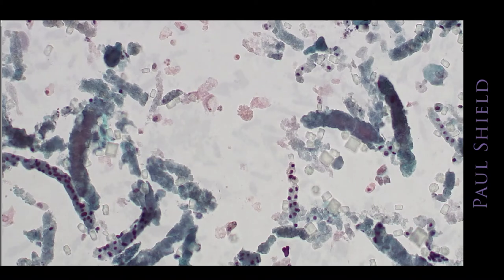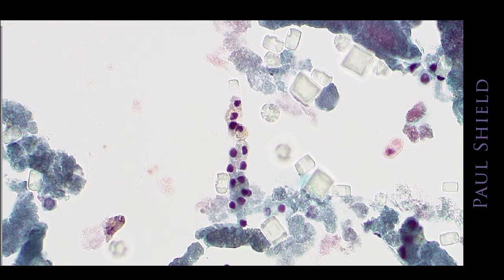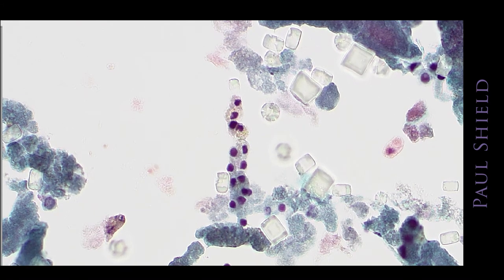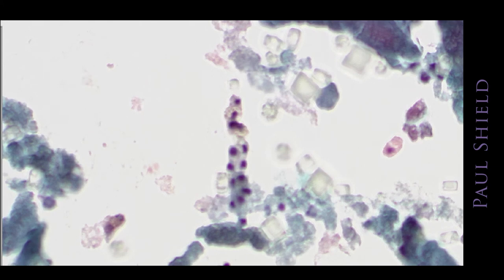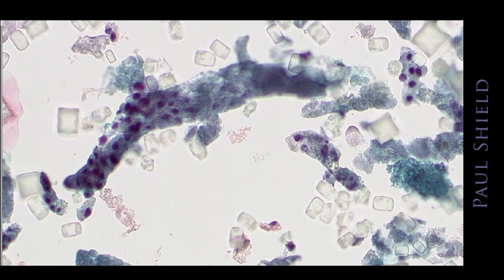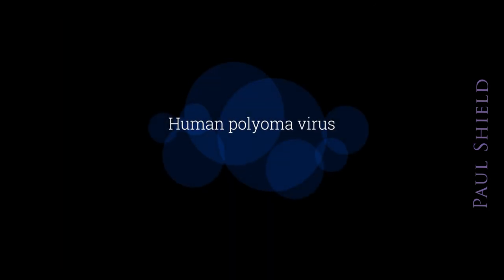And this is a case that's got extensive casts all over it. And some of these are cellular casts. So see this one down here has little dead pycnotic cells in it. These are renal tubular cells. So sometimes casts will come out with degenerate renal tubular cells present in them. There's another one there that seems to be cellular as well. But normally we don't see cells from the kidney in urine cytology, and we certainly don't see renal cell carcinoma.